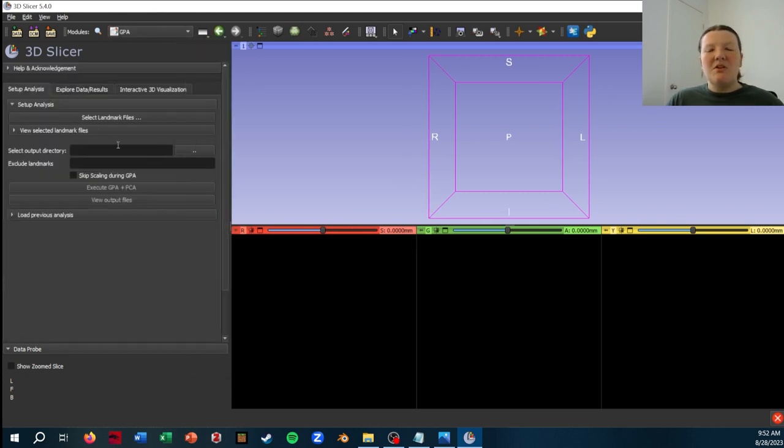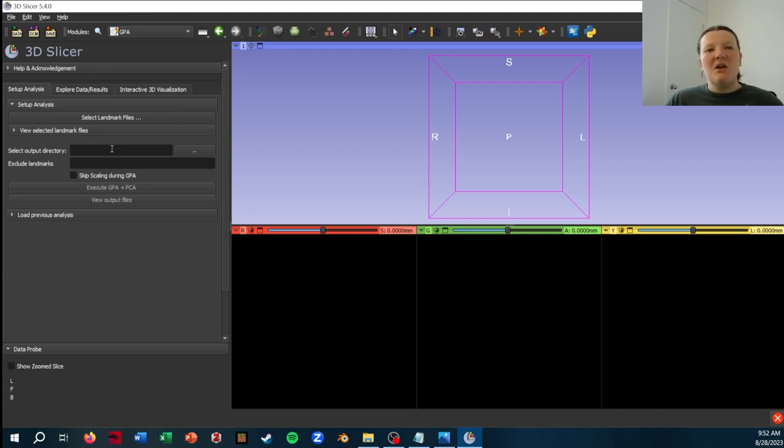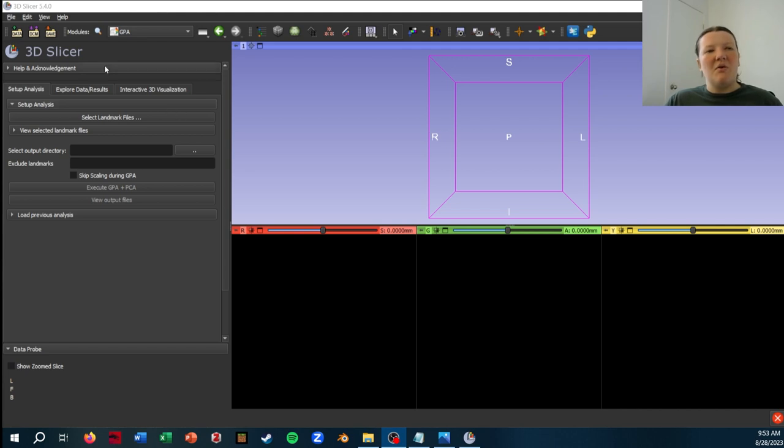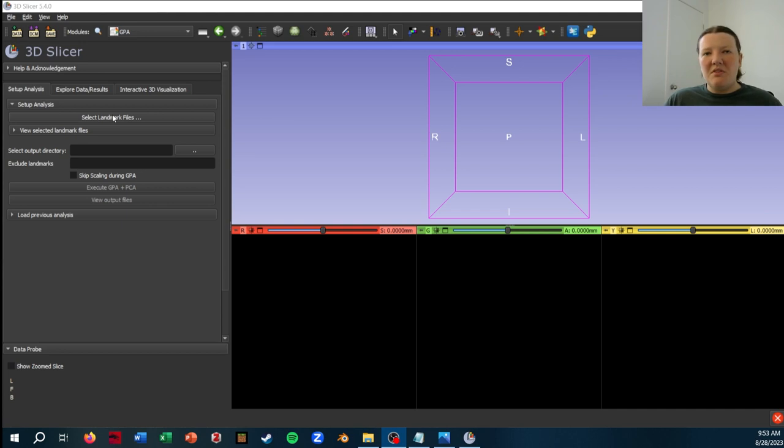Okay, so with the GPA or Generalized Procrustes Analysis module open, we can start by loading in our landmark files. So I'm not going to load data in how I usually would, which is by clicking this Add Data button. Instead I'm going to go within the GPA module and click Select Landmark Files.